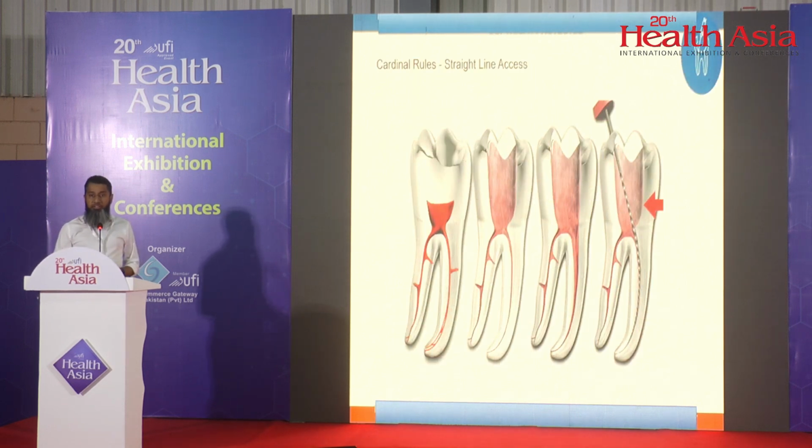One of the principles of access opening is straight line access. Why should we opt for straight line access? You can see that in the coronal part of the canal, there's a slight constriction. So that hinders the file going easily to the middle or the apical parts of the canal. So if we have dealt with that constriction in the beginning, then you have a more straight line access, so then you can go more easily into the middle third and the apical third.